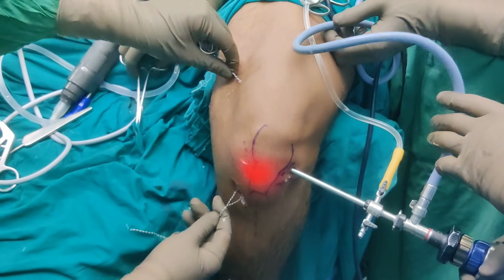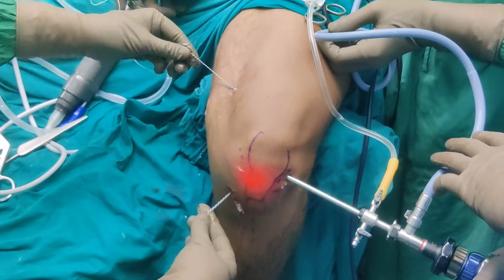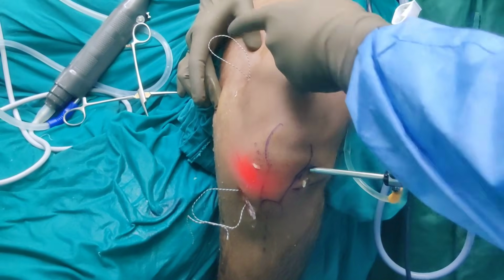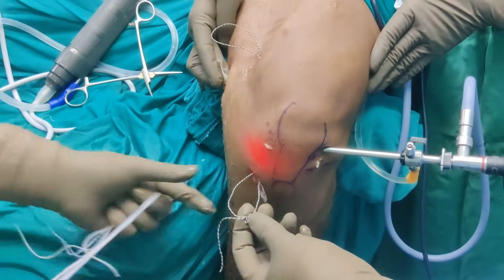Let's hope it's all fine. So beautiful on this occasion. God has been kind, no troubles at all. So we're just going to open this up, and the next step will be passage of the graft. So last time we had a loop here. This was an open end. We have made a few knots, and this has also become a loop.